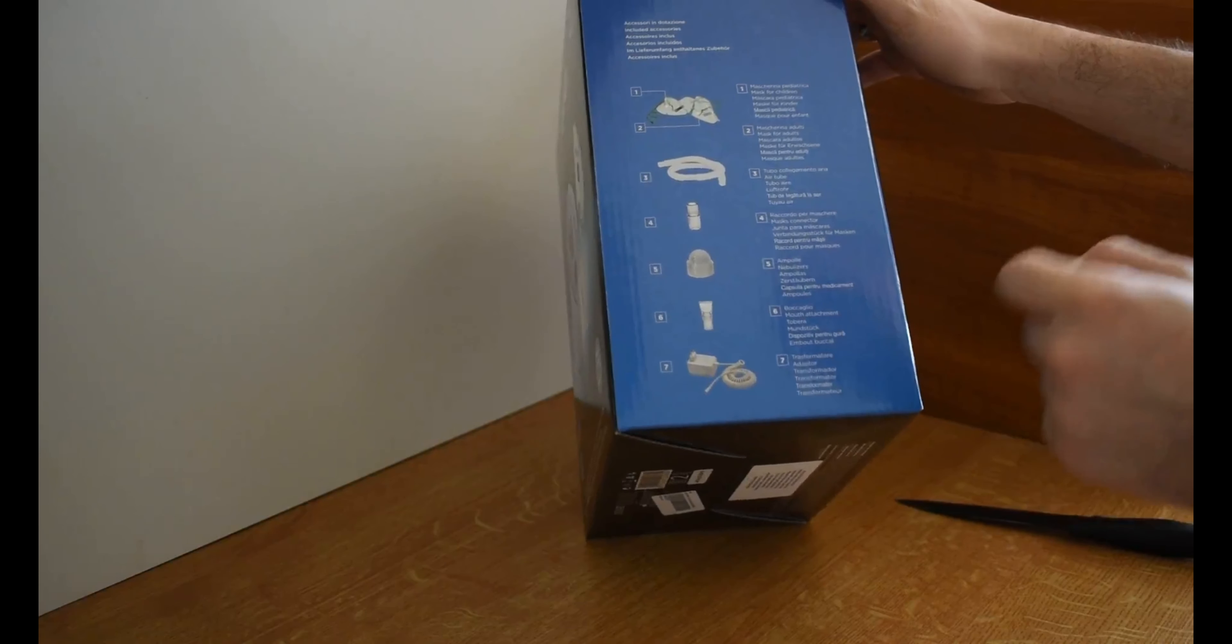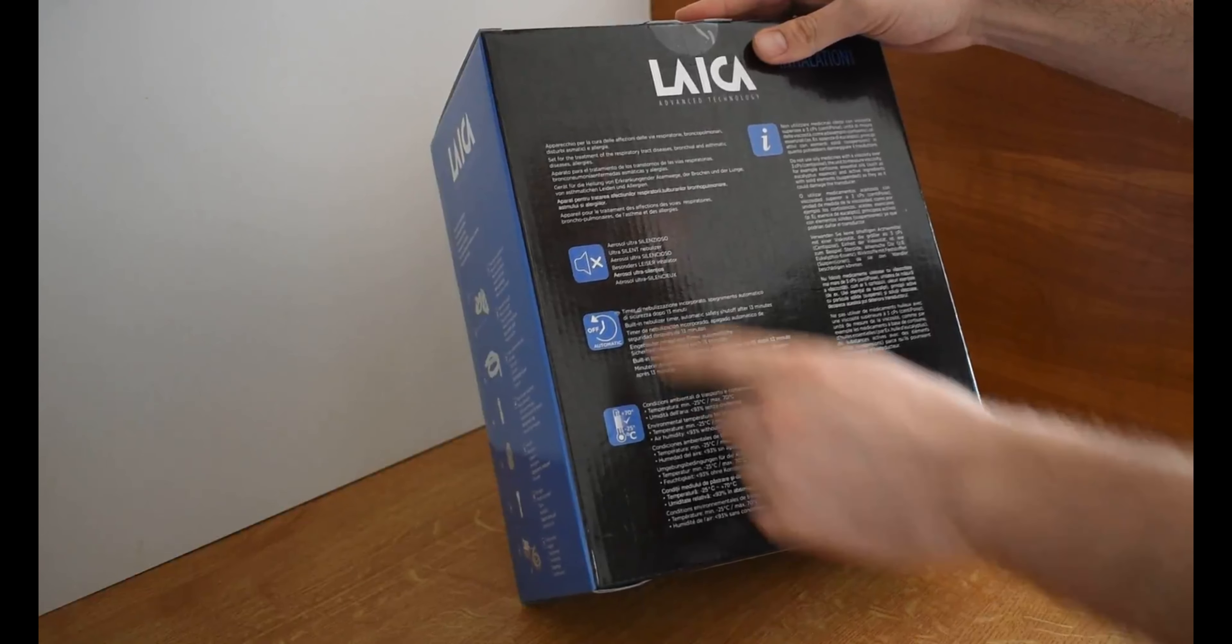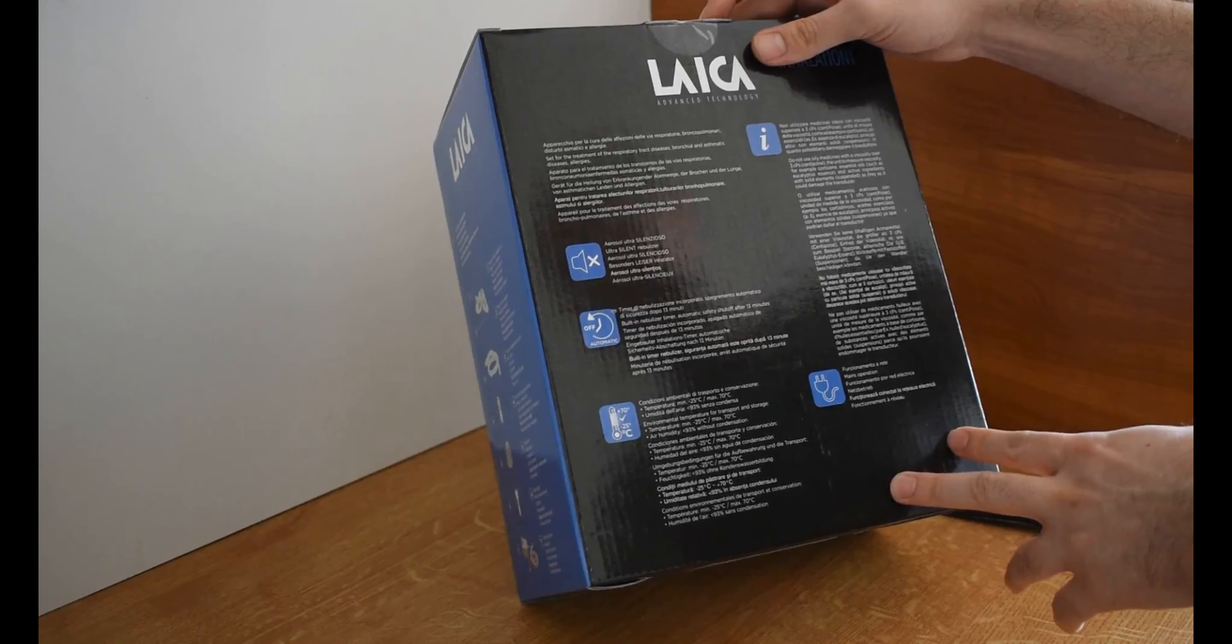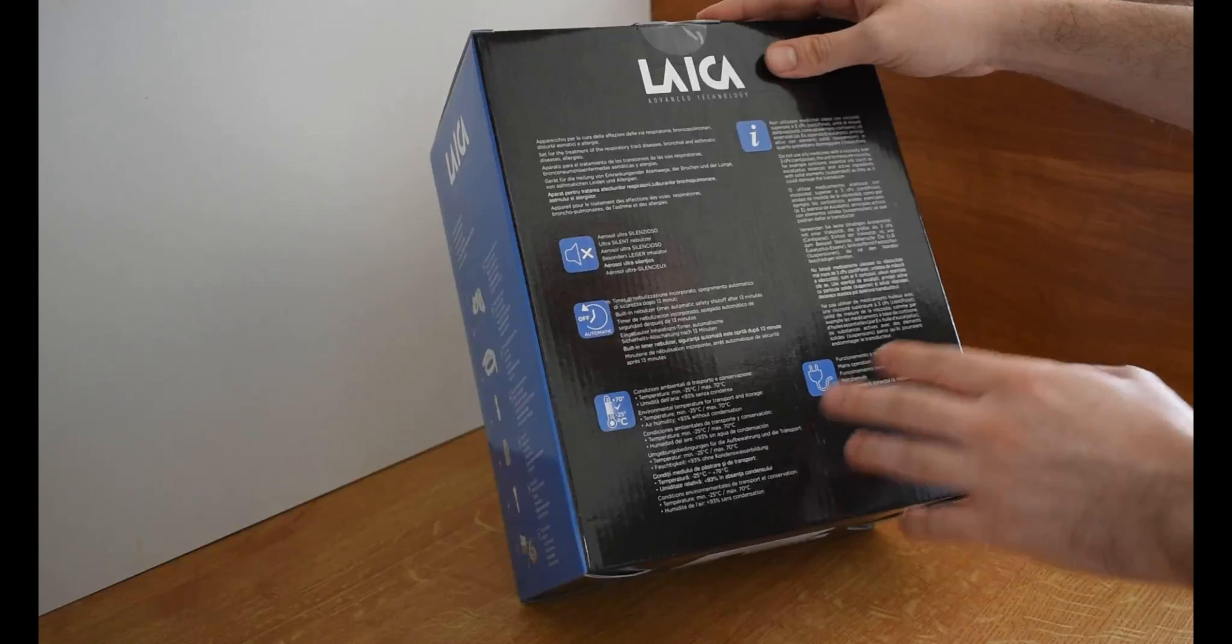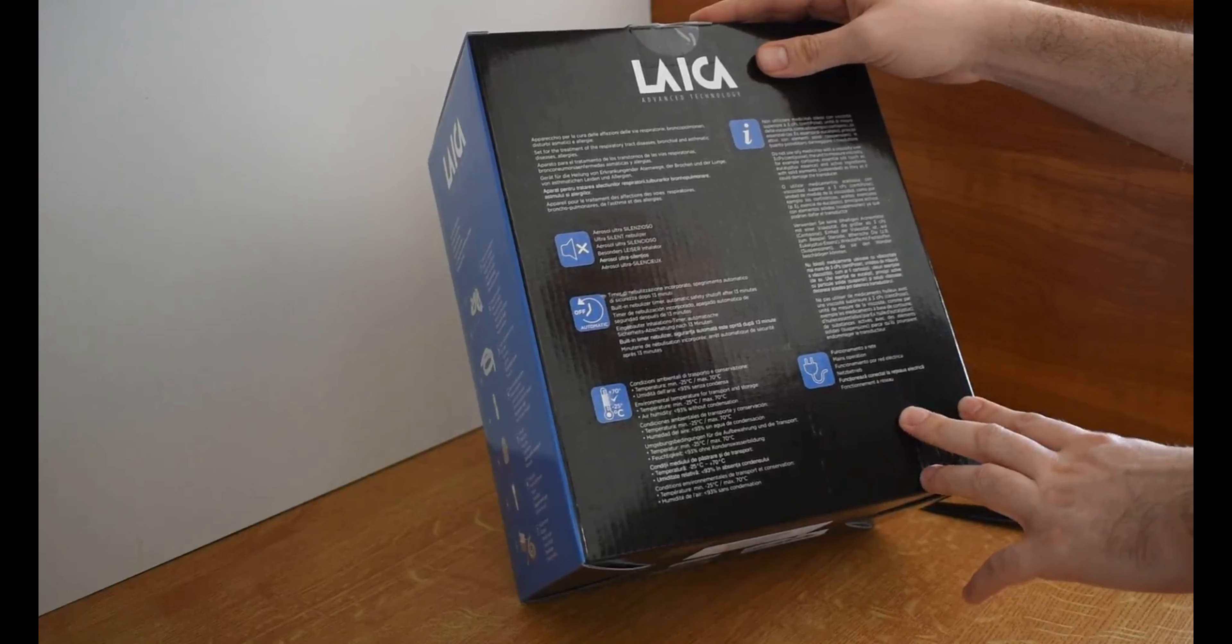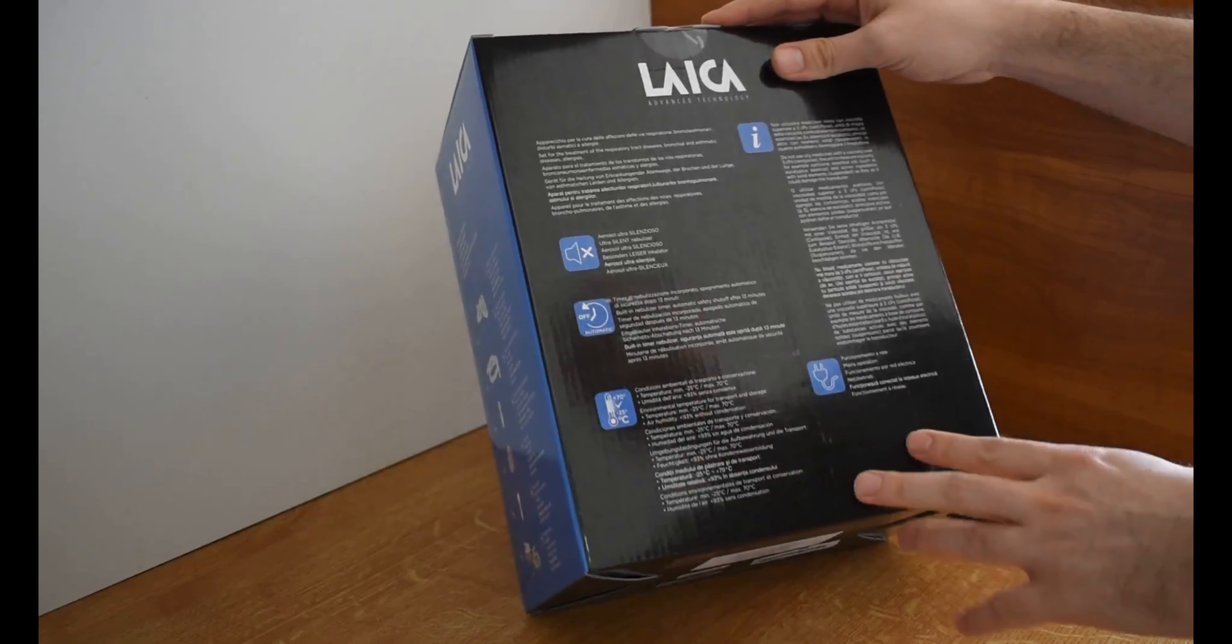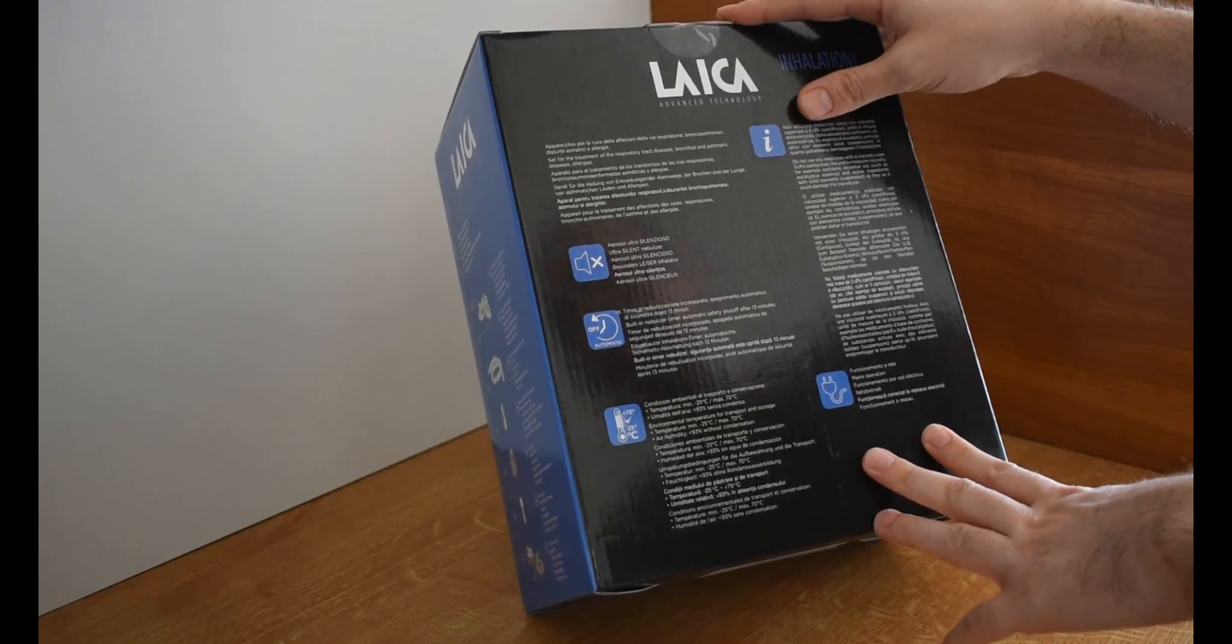So that's what is included inside of the box so far. Let's look at what we have on the back side of the box. One of the biggest reasons we have ordered this device is its ultra silent nebulizer. It's very quiet while it's working, which is great especially for children and of course it's not disturbing for adults. The next thing is that it has its own safety switch which is a built-in nebulizer timer, and in case of no usage it's turning itself off after 13 minutes.